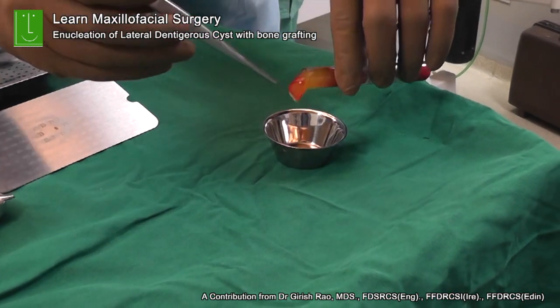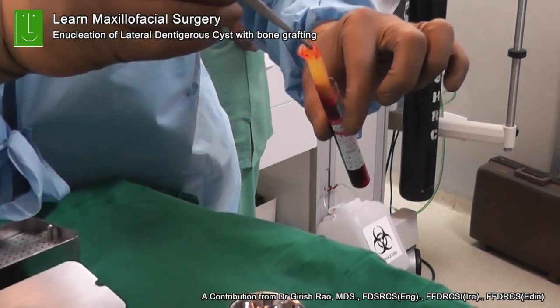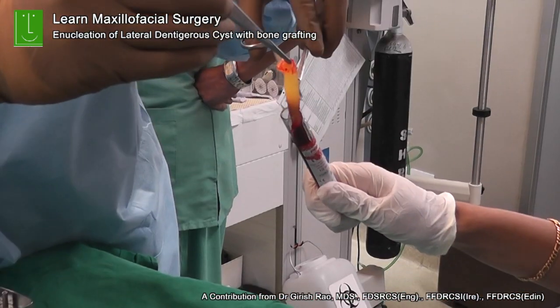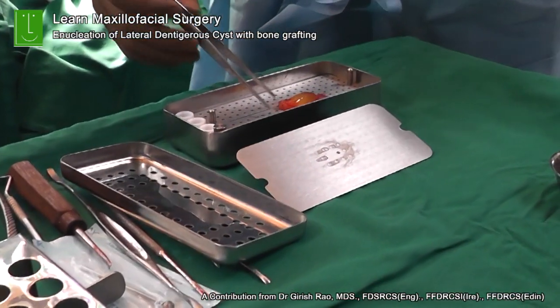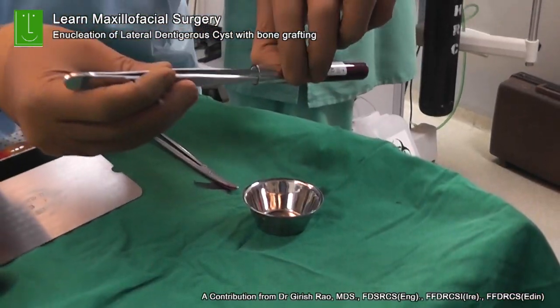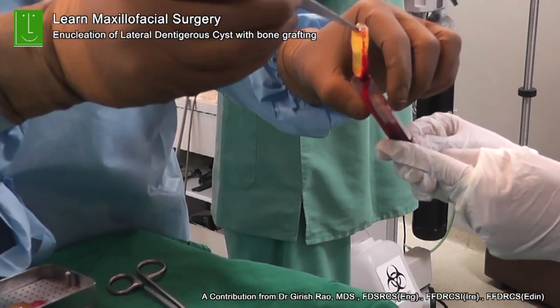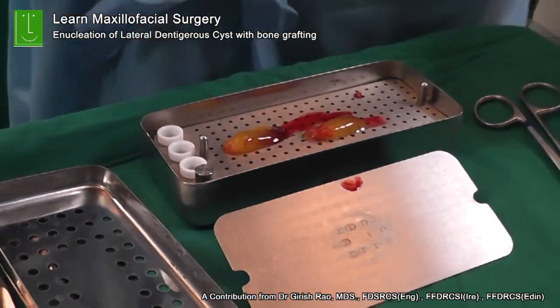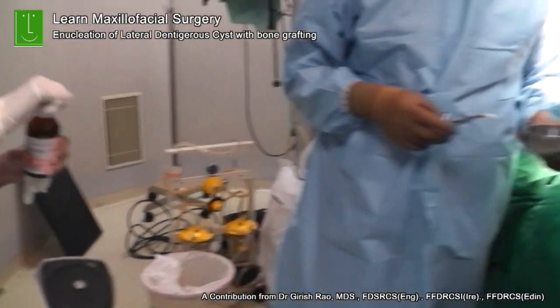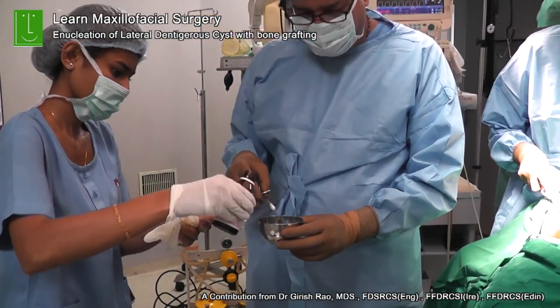That's the PRF. Whenever I do a cyst, I like to add to my graft material platelet-rich fibrin, or you can use platelet-rich plasma or the plugs which you can make, and I also use Carnoy's solution.